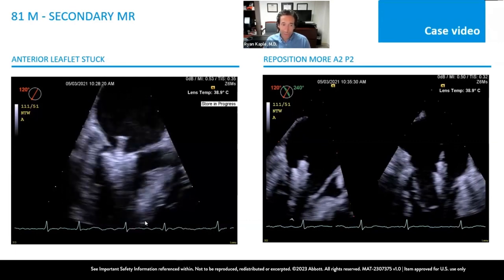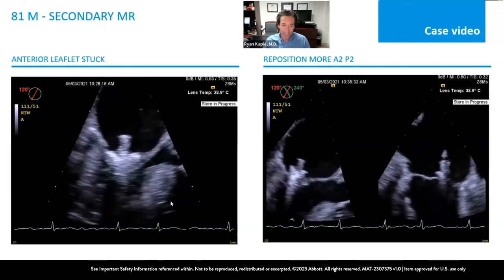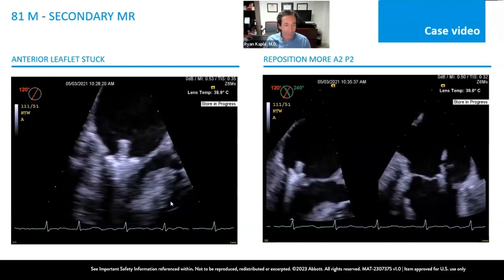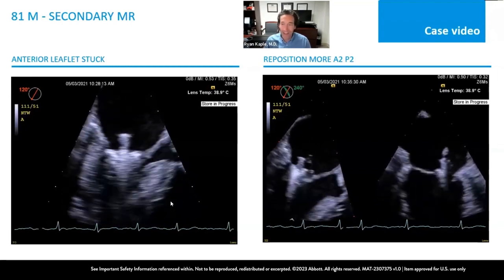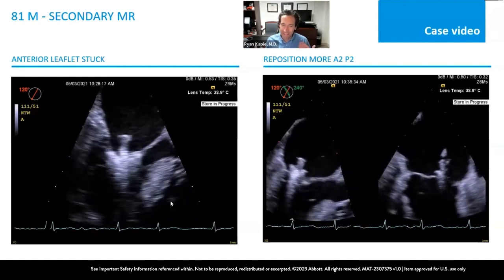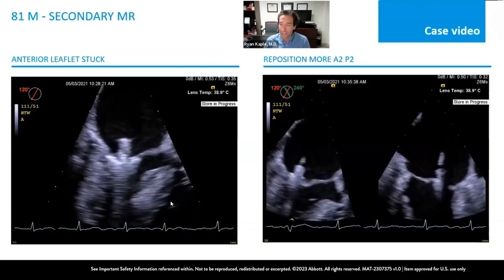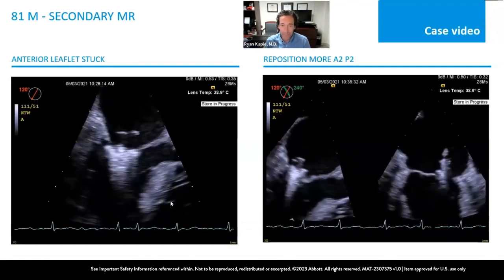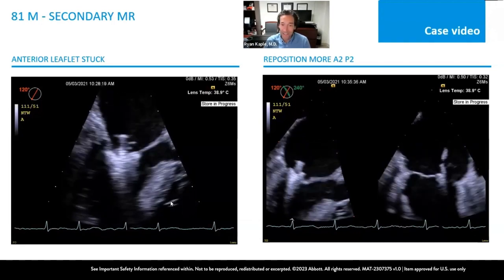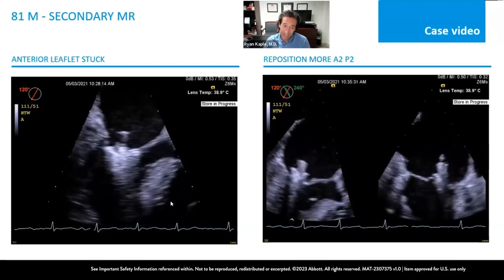And before we were able to do that, we did get stuck on the anterior leaflet, because again, you're running into a lot of cords as you get closer to the commissure. I feel like I could write a book at this point about how to get stuck and unstuck. Hopefully the latter part is true when you do get stuck, because it does happen a lot. The advice we always give is retrace your steps. Try to undo what you did, which can obviously be easier said than done. Nadira, I don't know if you have any tips that you've developed in terms of guiding people to get unstuck, but it can be challenging.